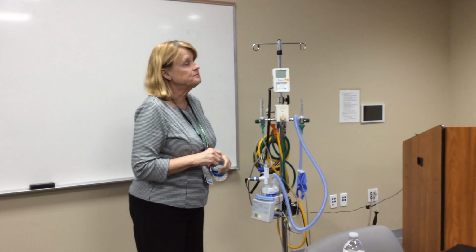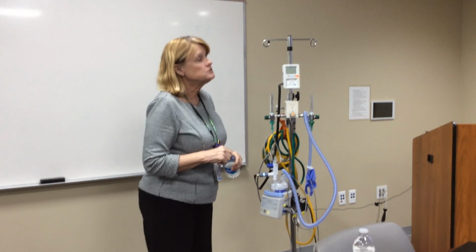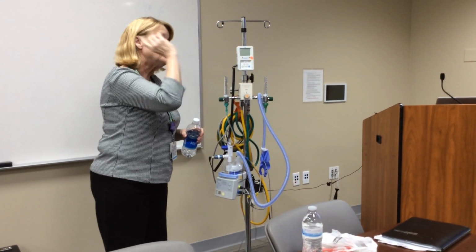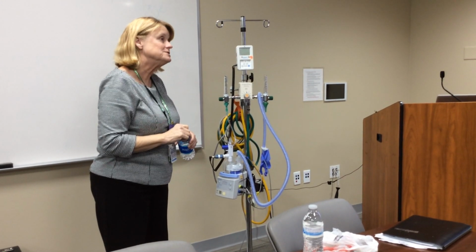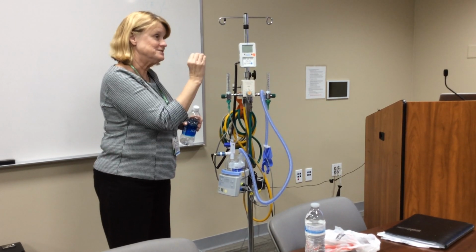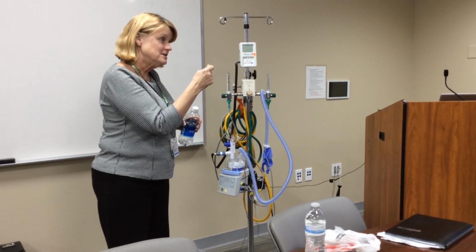Increasing it lessens the chance that there's going to be CO2. So we're really increasing that anatomical dead space flushing. Yes, and then the other thing too, of course, is as you increase the flow rate, you're increasing the resistance that they're breathing against.